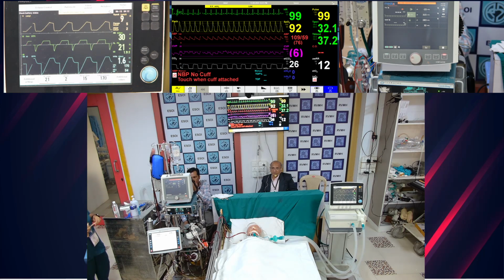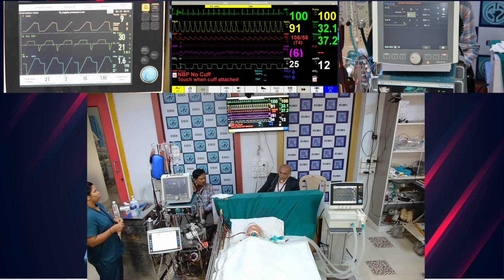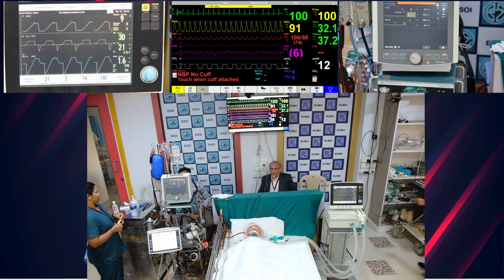What were the baseline pressures, sir, when the patient was put on ECMO? Circuit pressures are almost the same as what you are seeing. There's no change in the circuit pressures.